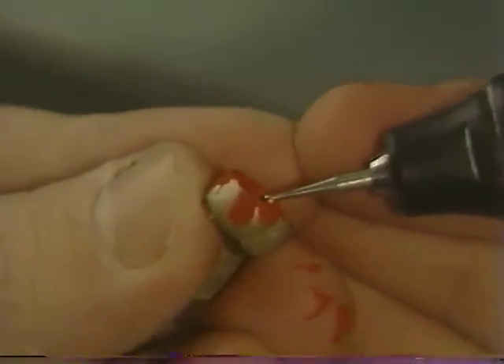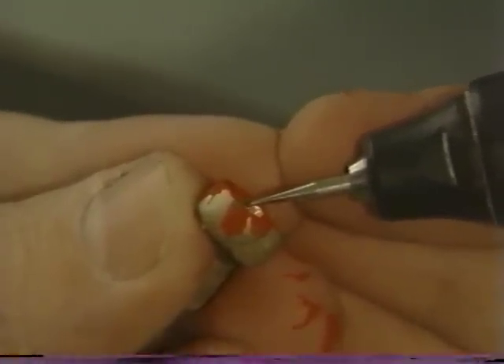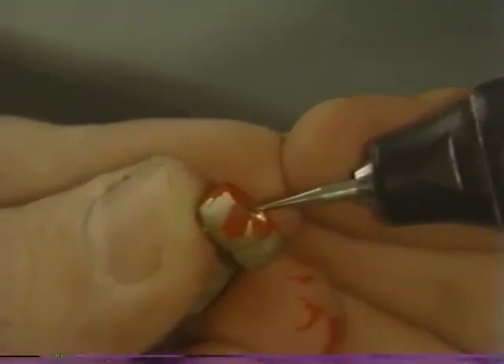The casting is then gently re-seated again until the point of meeting resistance against further seating is encountered, carefully removed, and the internal aspect is again studied. In this instance the crown appears to be binding in a specific area, and a small additional adjustment in just that area can be made. An alternative to this technique is the use of rouge and chloroform as a marking agent.